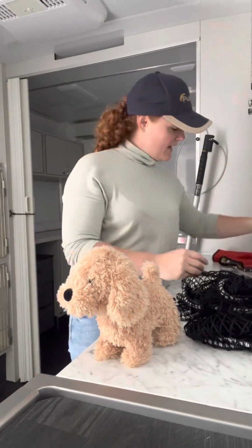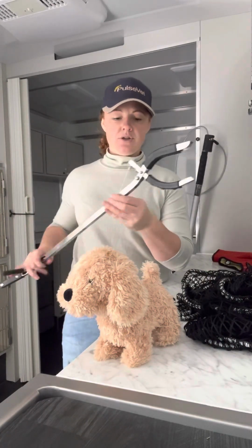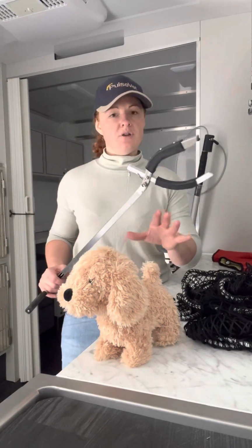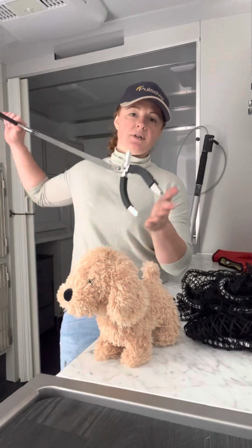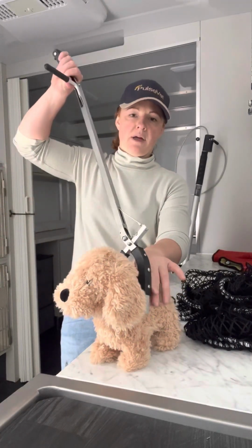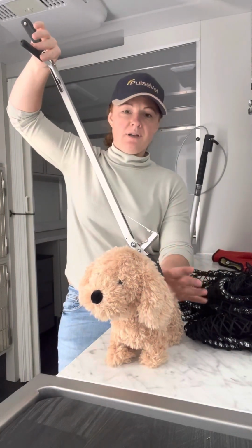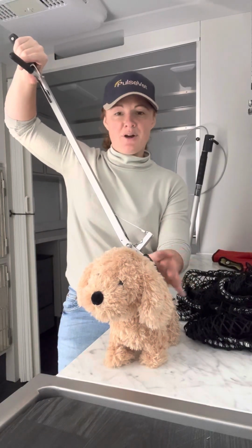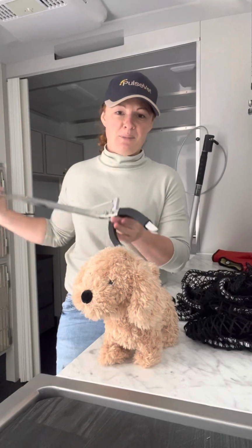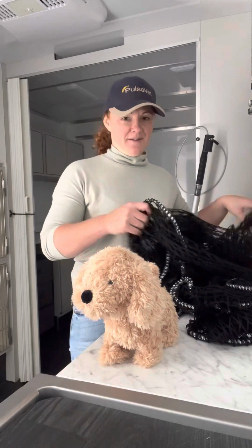The next thing we've got is the cat restrainer. So this is used if you've got an animal that is trapped or is in a cage and you need to access them. You can just use this. It's sort of like using your hands to place across the animal's back. You can pop that across the animal. You've got a little squeezy here just to restrain them, and then you're able to give them an injection, an anesthesia, some antibiotics, but without getting your hands too close to the front end, which is generally the bitey end, for the restraint.